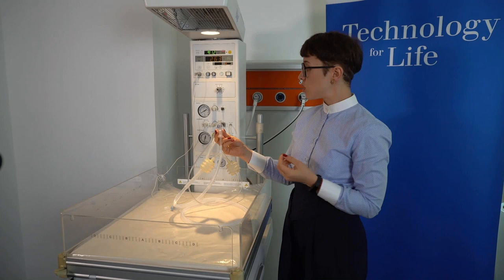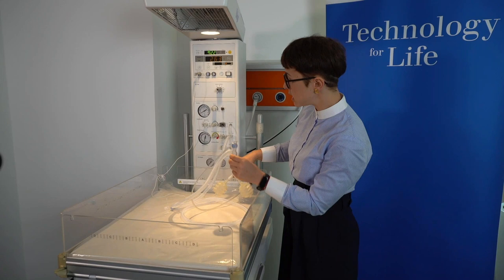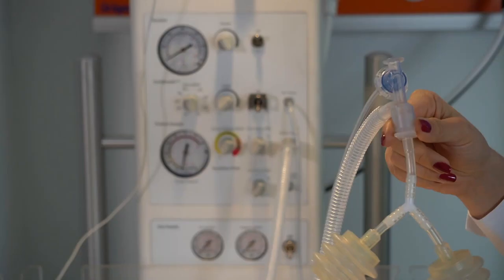So automatically, the device is giving me an alarm again. We need to check the patient, of course, because the time has passed. I acknowledge this. So now we see we're ventilating our patient between the setting of PEEP, the setting of the airway pressure and the respiratory rate. And the device is ventilating. So let's have a closer look at the settings.